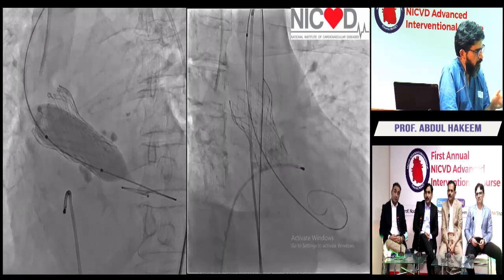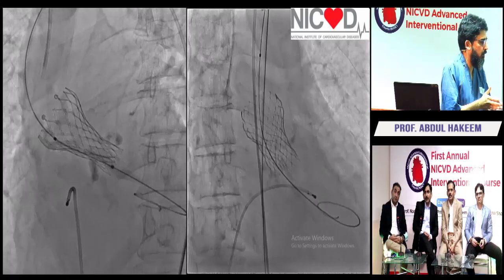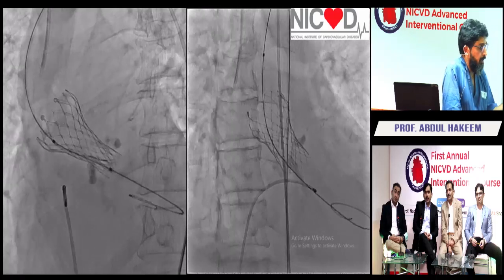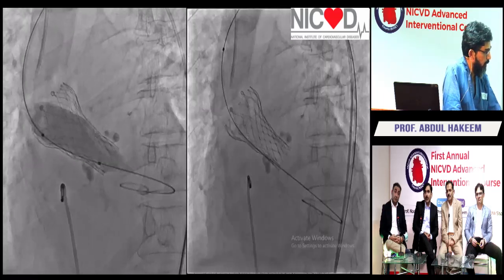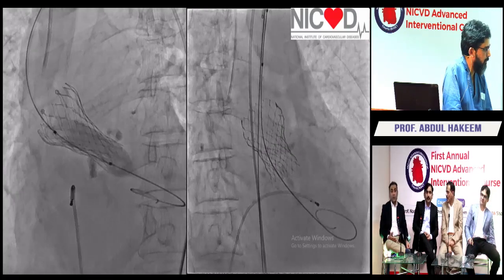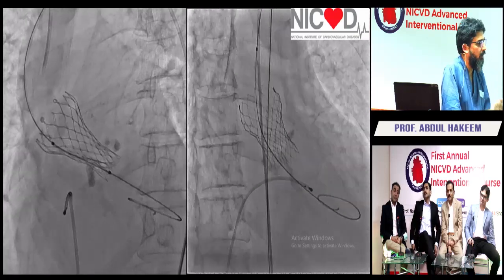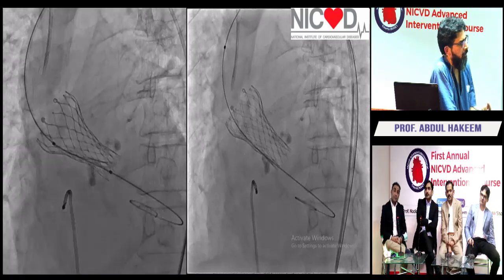You understand? Because you formed such a tight seal in the supraannular structure. So you have to be very careful. Ideally, you would want to put a snare. Now, the other thing is, if you deploy the valve and the patient goes into incessant VFib, what happened? You're like, what happened to the patient? You have to look for the ischemia, the obstruction of the coronary. A life-saving measure really is to snare the valve. That is one very rare instance where you would intentionally snare the valve back.